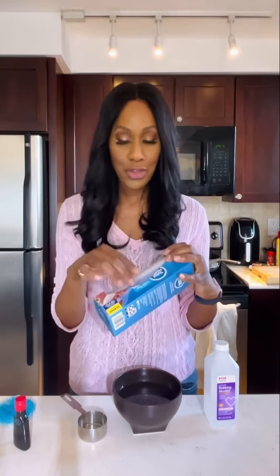I am using 1/3 of a cup because that's gonna be the unit size that I use for the ice gel pack that I'm making, but you could use a full cup, you could do whatever size you wanted. You just wanna make sure the proportions are right. And I'm gonna tell you what those should be. So I got 1/3 of a cup here. Also, if you wanna be fancy, a little food coloring. I'll show you what we're gonna do with that. And the last thing we need is some plastic bags, which is actually what I'm gonna use to make my gel ice pack.